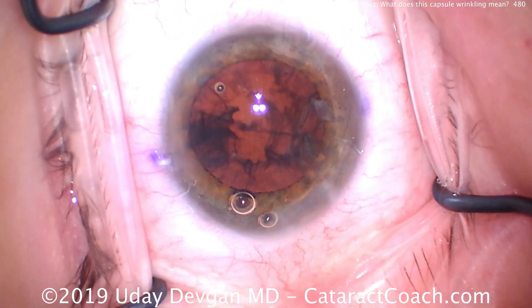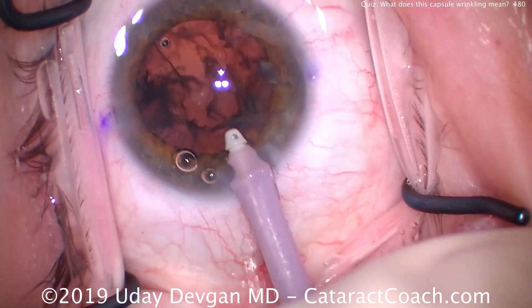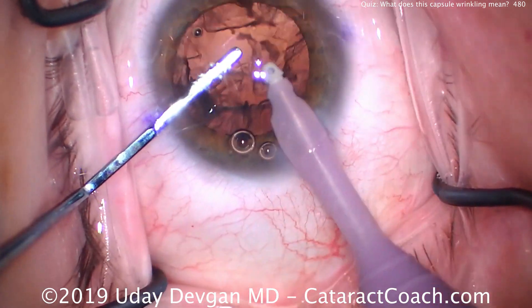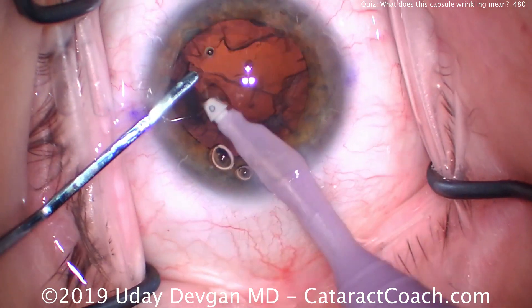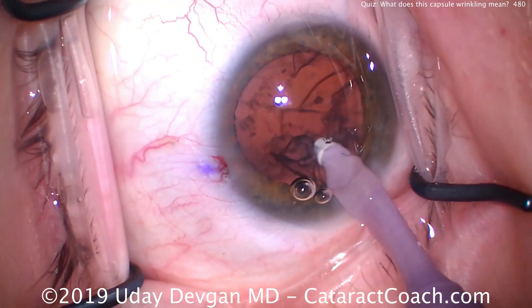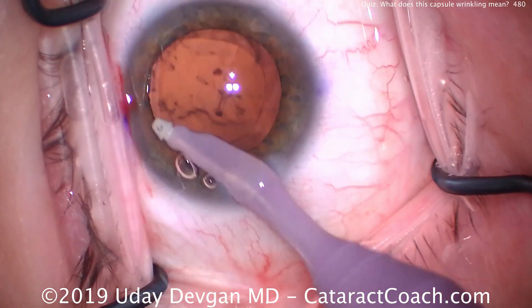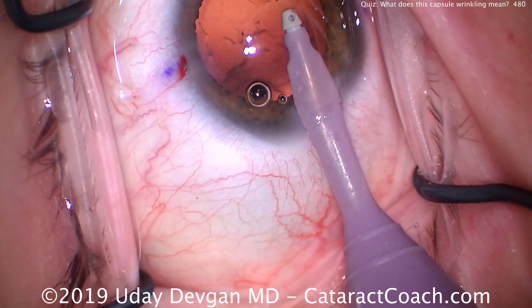We need to get the cataract out and we want to make a sufficiently large capsularrhexis. The reason is these patients tend to get capsular phimosis. In most of these conditions — whether it's pseudoexfoliation, retinitis pigmentosa, or some other process — there tends to be more late-stage capsular phimosis where the anterior capsule rim shrinks down. During cortex removal, watch carefully: make sure the capsular rhexis edge isn't moving. If it is moving, that tells you the zonules are being stretched and broken, so be very careful not to damage them further.